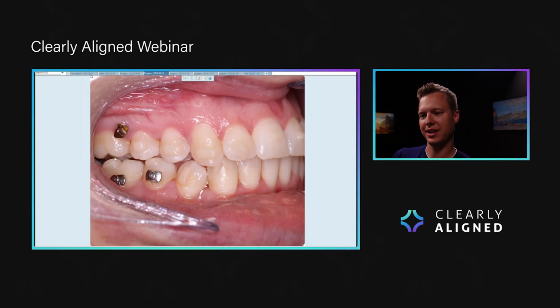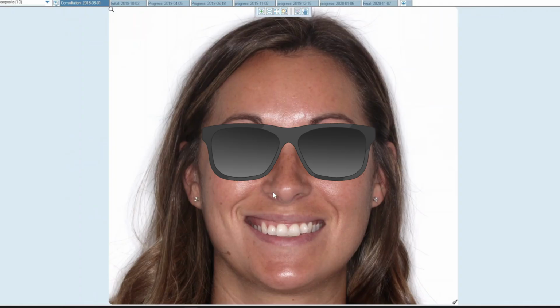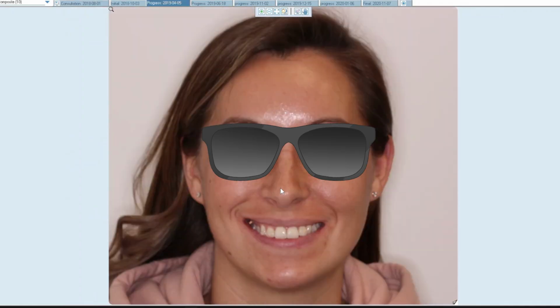And you notice we actually start getting a little bit of a posterior open bite, which is fine because we just need to finish extruding those lowers after that. So what you're going to notice when this patient comes back for a refinement, let me go back to here. So here's her initial. This is 6 months. The TADs can actually move teeth quite quickly, relatively speaking.